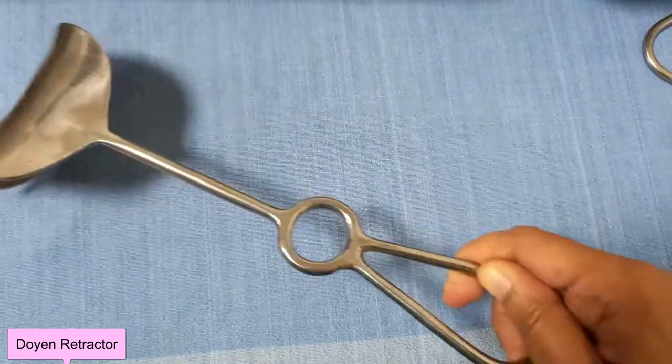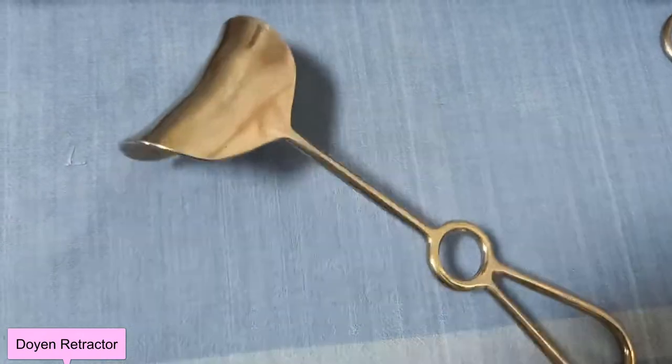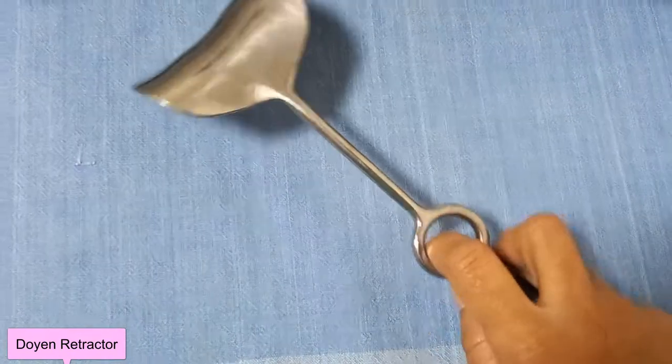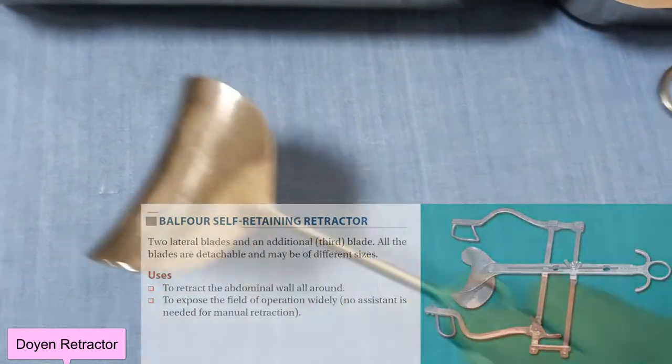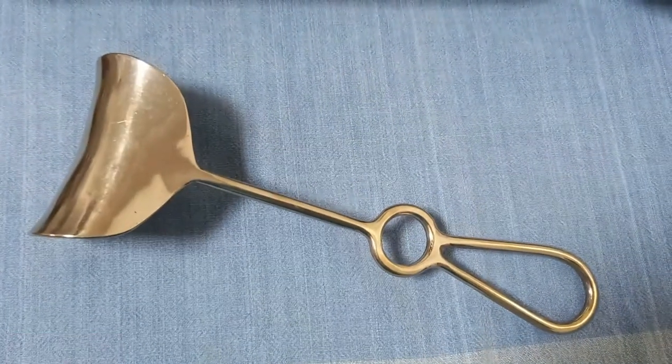Remember to remove it when the baby is coming out and then reintroduce the retractor. This is not self-retaining — if you want self-retaining, you have to use the Balfour self-retaining retractor.